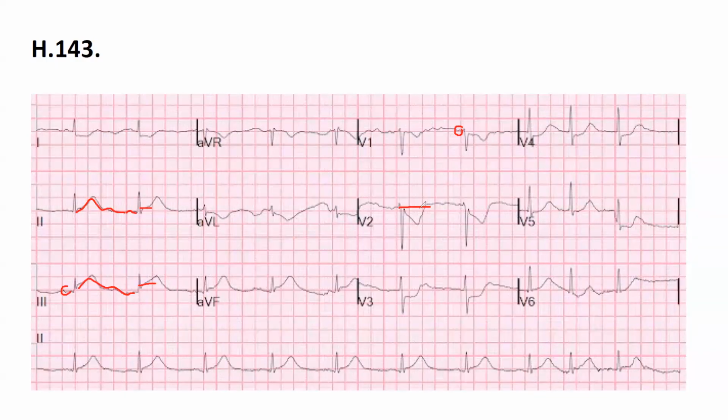So I know that a high T wave can point towards hyperkalemia. This T is not high. This is not high. All right. Well then, because we've got ST depressions in V2, V3, and V4, I think this is indicative of ischemia in the posterior. Okay, that's more than ischemia. That's a lesion, or you can say that's a STEMI. So posterior STEMI then. That's an infero-posterior STEMI, okay? Infero plus posterior, all right?